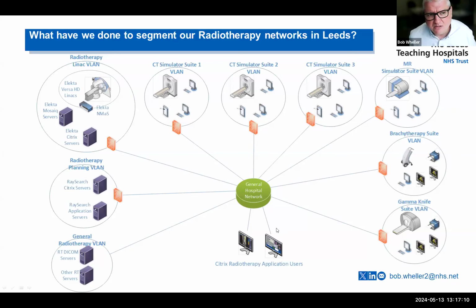Just to mention at the bottom there, you can see that we actually serve out the applications onto the hospital network over Citrix. So the only thing that actually leaves the medical device networks in terms of general computer access is a Citrix session.